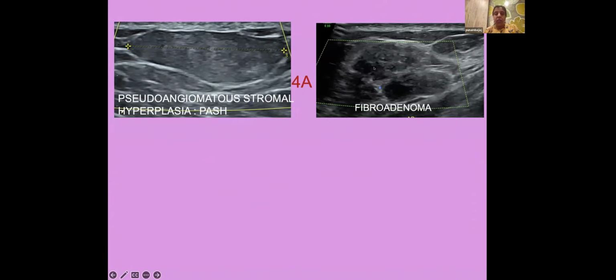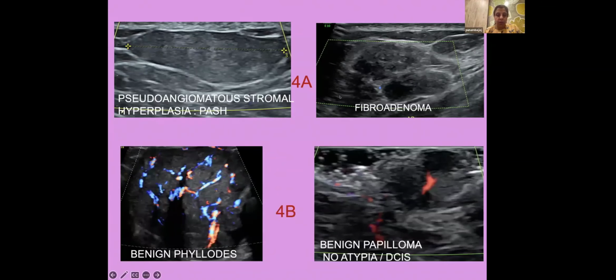Another case, circumscribed lesion, but it has a heterogeneous echotexture, cystic areas within, okay? And we thought it was a fibroadenoma, but we were not sure given these cystic areas. It wasn't that classic hypoechoic fibroadenoma. It was biopsied and it turned out to be a fibroadenoma, 4A concordant. Now, this is a lesion with few fluid clefts. Can you see these anechoic areas? And you see a lot of vascularity within this lesion, okay? This is a classic appearance for a Phyllodes tumor, but you need to biopsy these given this appearance, and this came back as a benign Phyllodes.